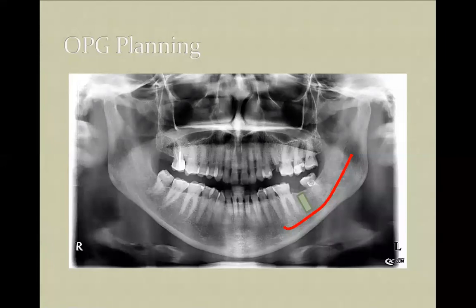We do not have cone beam CT scanners in our country. So I was trained by means of the OPG, and up to date, I'm using OPG mostly, because I'm doing a combination of my clinical experience and the radiological data.